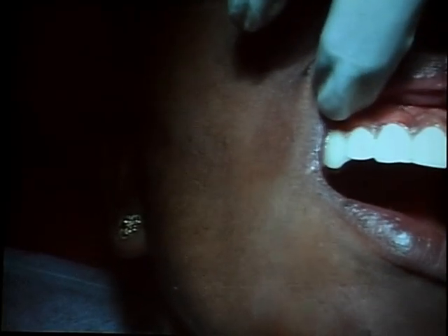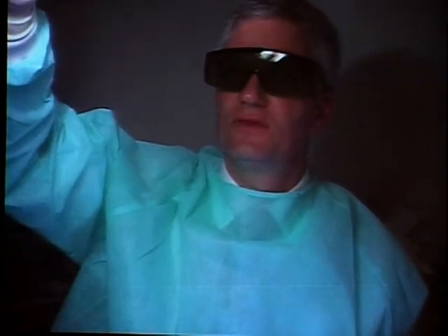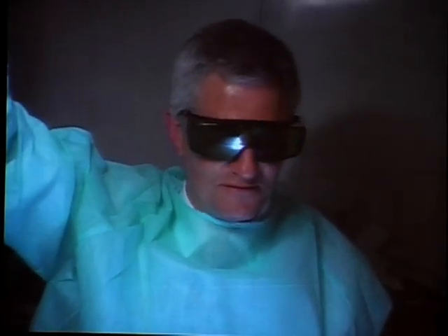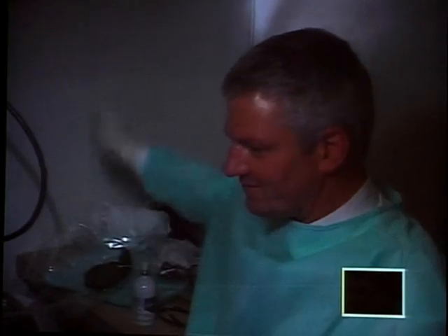So no anesthesia, you can do this every 3 months to the patient even if you have to, which you don't have to. And patients are comfortable. You may have to revise it again. You need to wait for 48 hours to actually see the proper effect of it. And if you feel that there are some areas left, the patient can come back again and you can revise that. Because you don't want to overdo it the first time, you may want to underdo it and then revise it. That's a better option that you have. And of course, you don't charge the patient again.